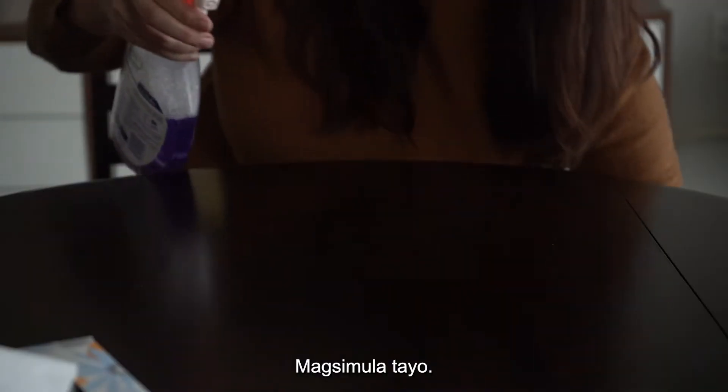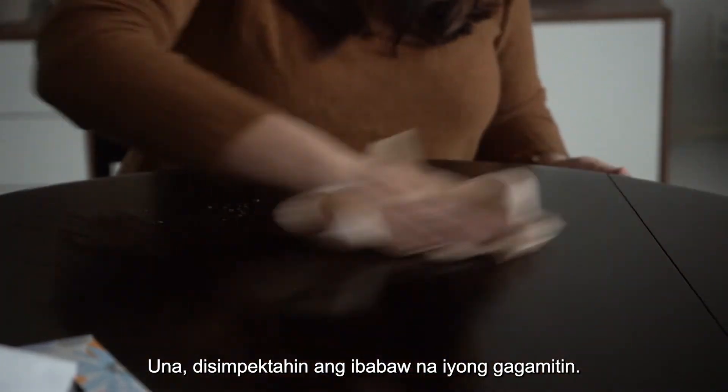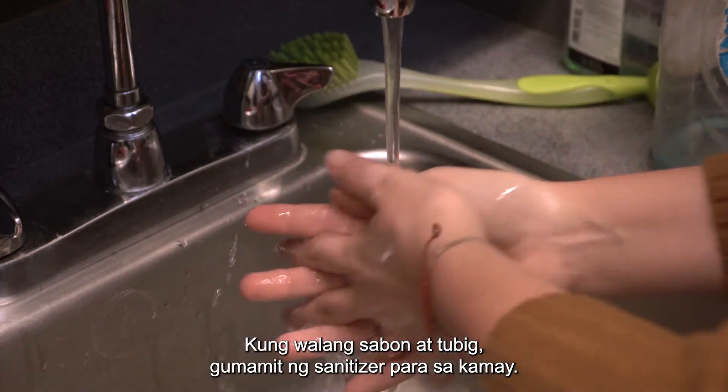Let's begin the test. First, disinfect the surface you will be using. Then wash your hands. If soap and water aren't available, use hand sanitizer.